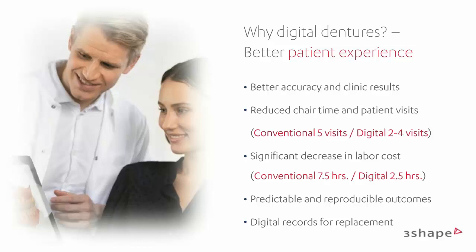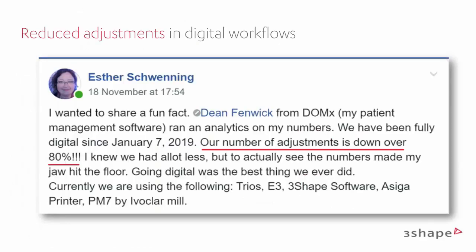So good fun. Also, I want to share a post from one of our really good users, Esther Schwinning, who just extracted some numbers from her lab patient management system. And she's basically seeing that the number of adjustments is down over 80% since we started digital. This is fantastic. I mean, it's amazing, 80% down in adjustment.